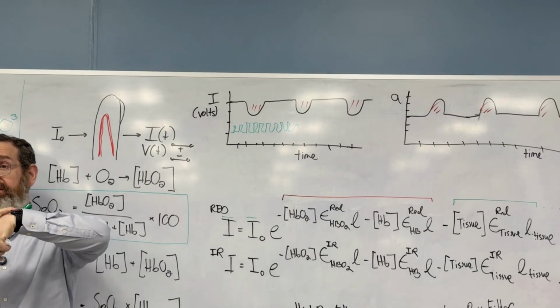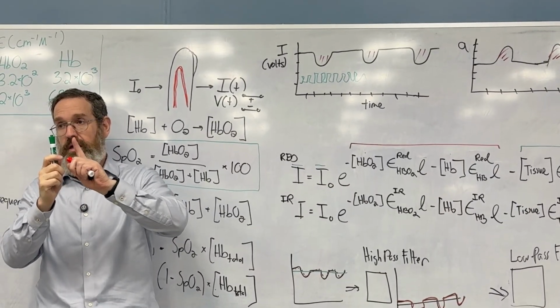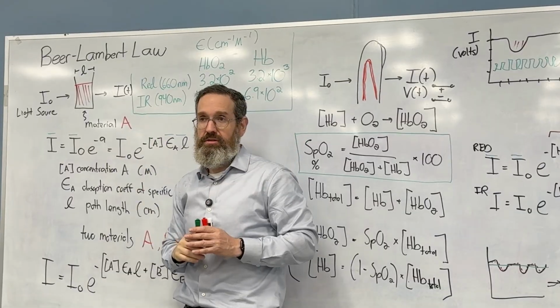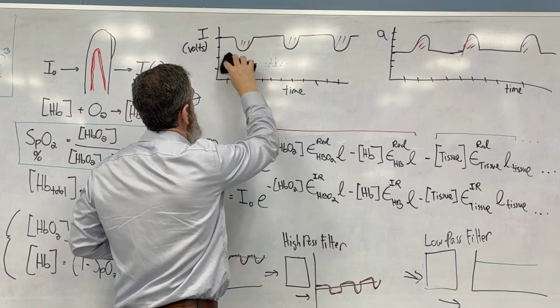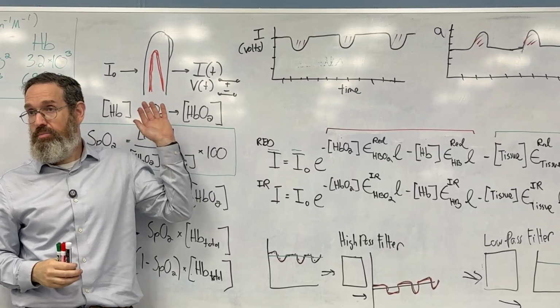If you look closer, you'll see that the lights are actually flashing. And I don't know if you can see this, but it's actually alternating between two different light sources. You need one, and you can use the same detector, by the way. So theoretically, you can use two detectors, but you could also use one detector. I don't want to talk about that today, but I'm really happy you brought it up. Let's put that as another layer of the onion. I just want to focus today on this part of it.